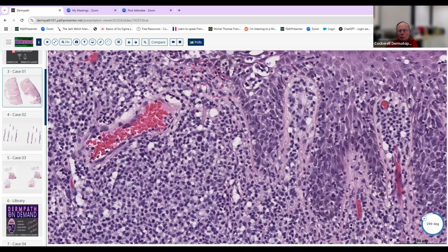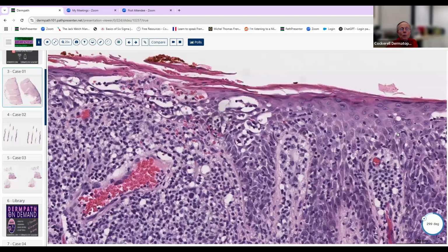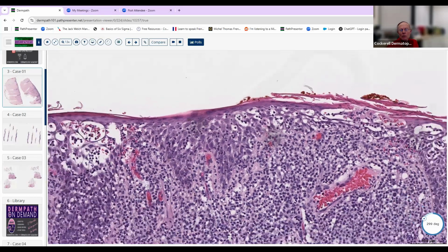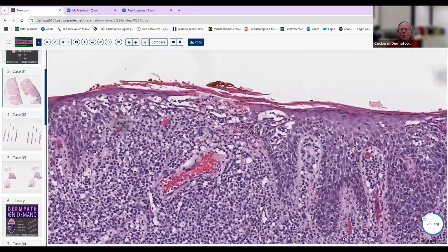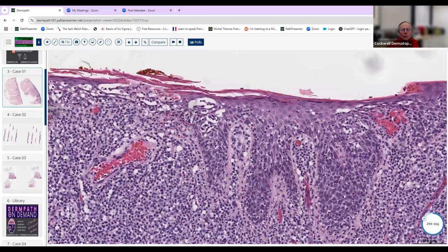and they're not just confined to the dermal junction, although that's kind of where they start off. They're present pretty much above that, and in some cases almost confluent through the epidermis, like in this area here, giving kind of a pagetoid pattern. So this would be very, very suspicious for MF or one of the MF simulators, basically.